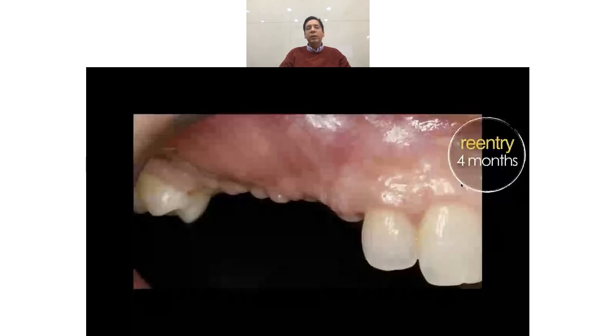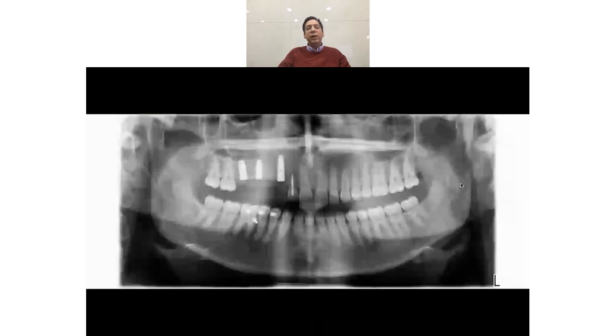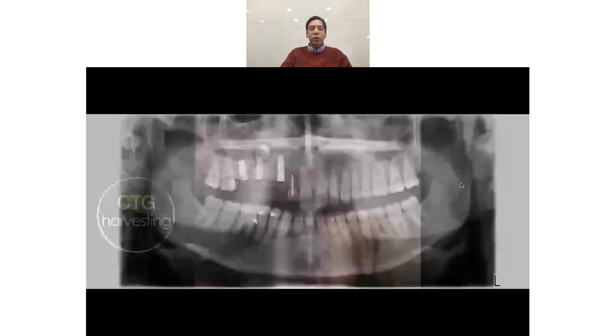Here we can see the re-entry 4 months later. And 4 months later, this is the radiographic aspect. We can see the nice bone formation in the root tip. So I think the apicoectomy had been a success. And we can also see the implants in the right position.